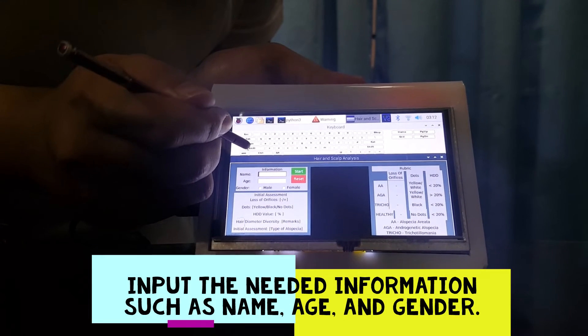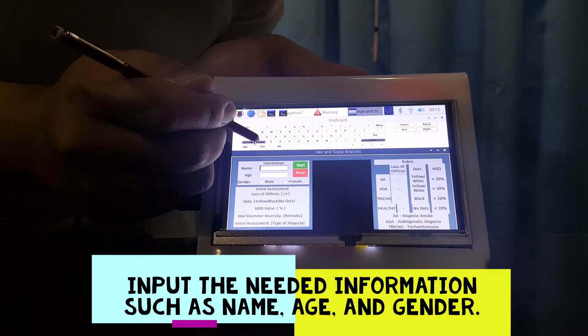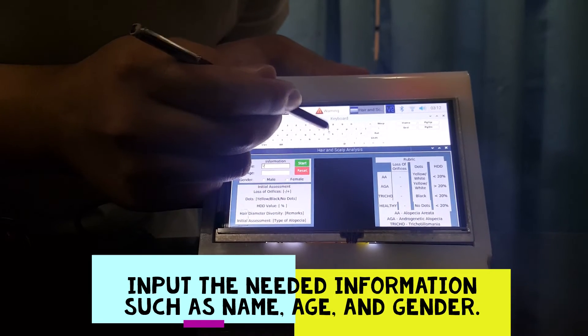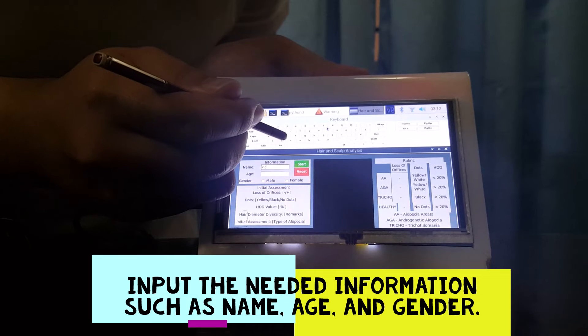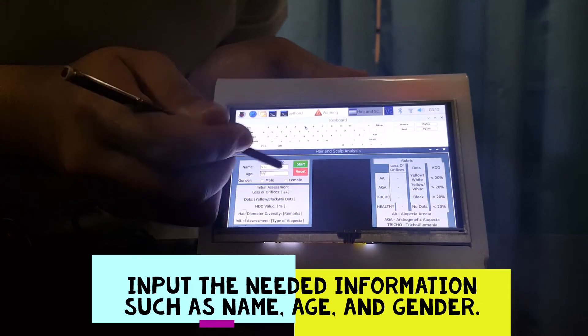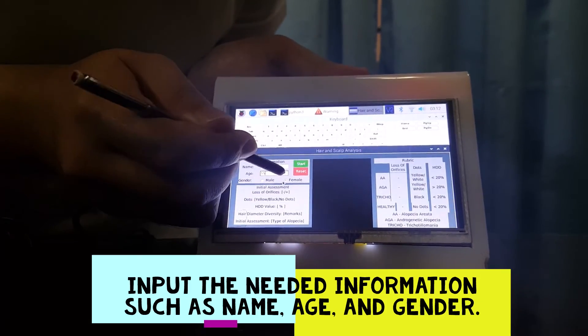For profiling, input the needed information such as the name, age, and gender.